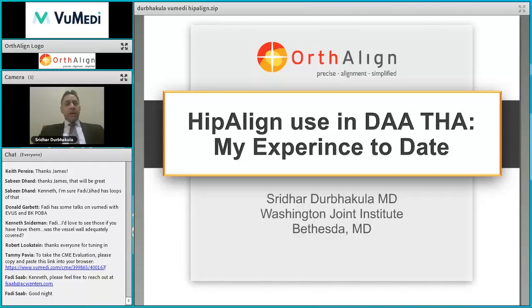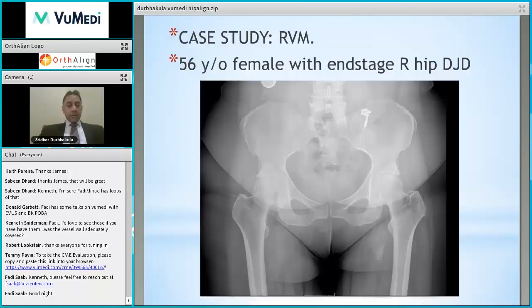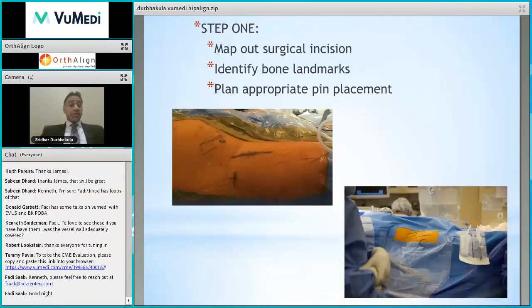Just talking a little bit about my experience with HipAlign and its use in direct anterior total hips, and a little bit about my experience to date. So basically, here's a case study of a typical example of a patient who needs a hip replacement, and it walks through our steps real quick. I know we touched on a lot of these points earlier.